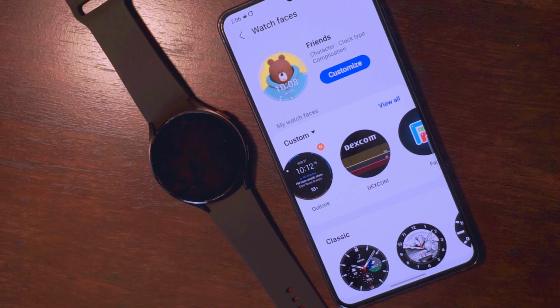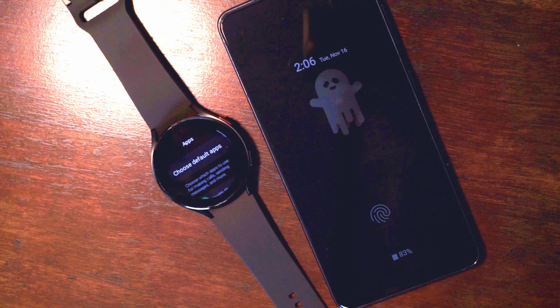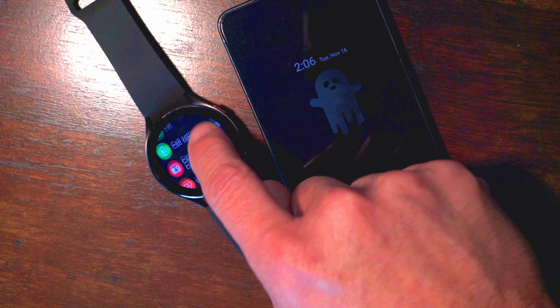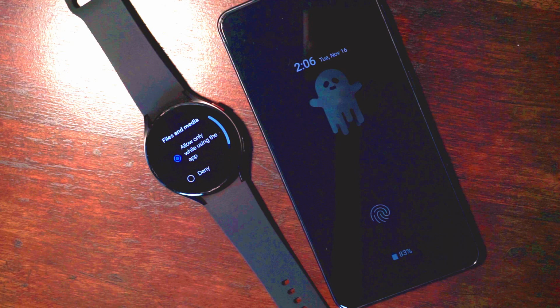Now the following two steps, I didn't read anywhere, but I just tried as a Hail Mary because I was so determined to get this to work. So once installed, go back into your watch settings by swiping down on your watch. Click on the settings and scroll to the apps. From apps, you will tap on permissions and then scroll down to the G6 app. Click on Files and Media, and then tap on Allow Only While Using App.